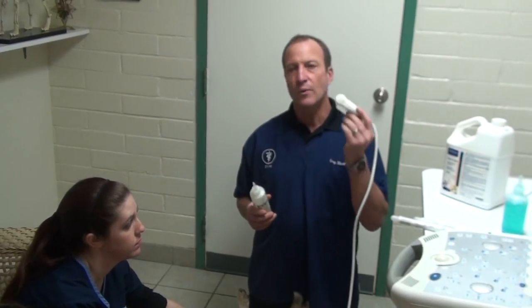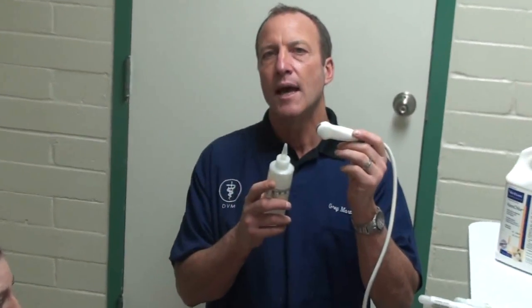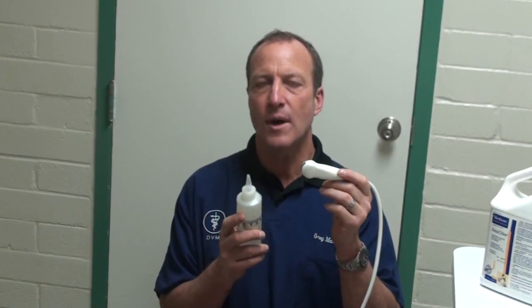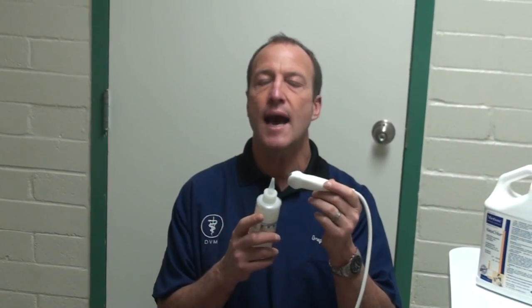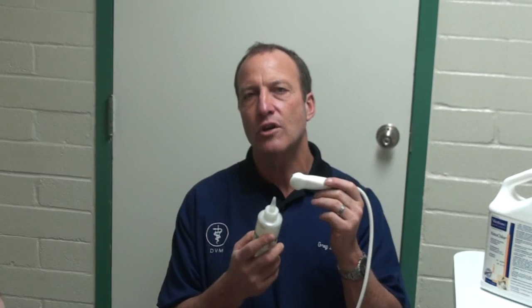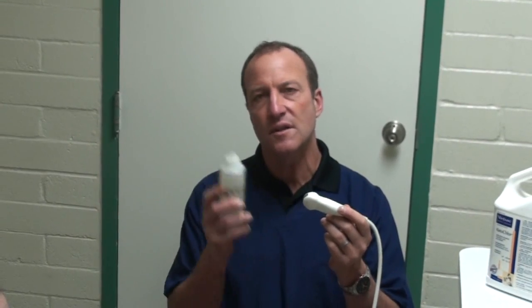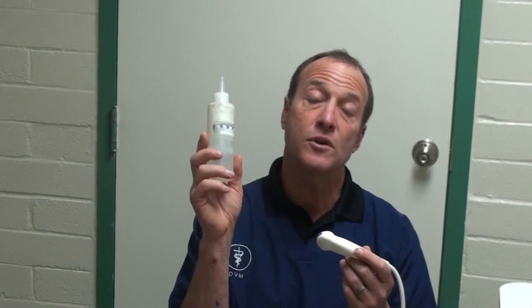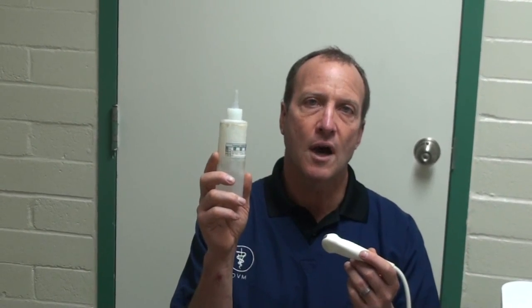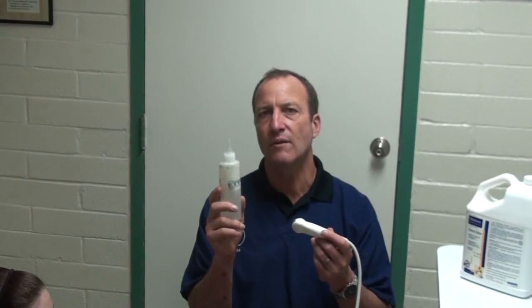In order to do an ultrasound we need a probe. Sound comes out of it and bounces off organs — it bounces off solid organs and goes through water, and that's how it makes the picture. The waves are translated by a computer to make an image. For good contact between the probe and skin we need alcohol — not beer or wine or vodka, but isopropyl alcohol. Sometimes we'll use gel also for good contact. We don't need a big area, just the middle of the belly.